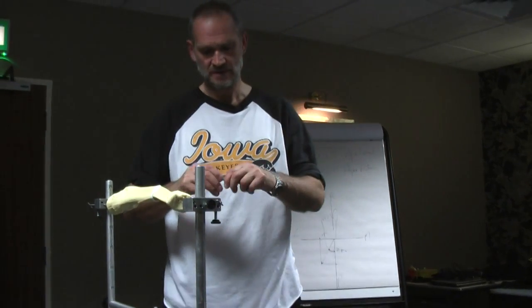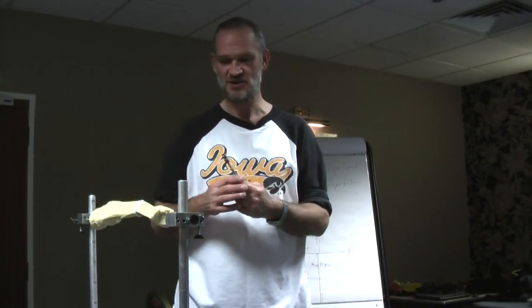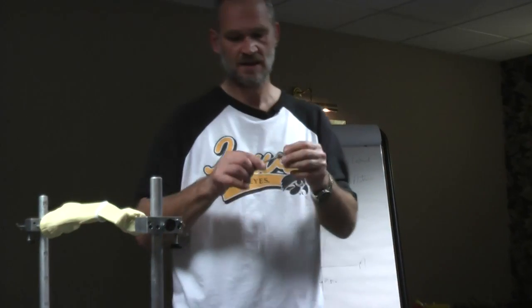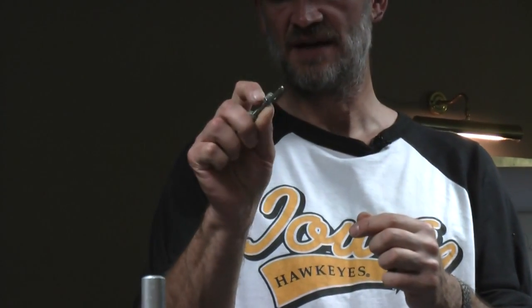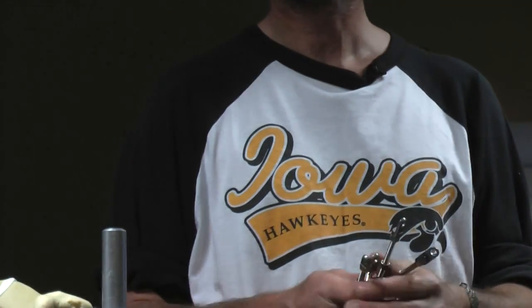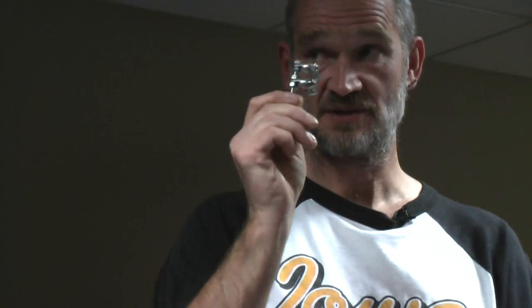And the only other bit of pre-build, and those of you that ever had to do one of those WHO checklists before you operate, this is what I do while they're doing the WHO checklist, which is build some hinges. And a hinge is basically a threaded rod with a high profile male tightened onto the end with a nut and another nut down there. Female, sorry. So 4 of those. And that's just a motor for the back. You can do it with an extra one of those, but we'll talk about why I use this later on. Okay, so that's all the pre-build you need to be able to do. And as I say, you can do that while they're counting the patients or whatever it is they do.